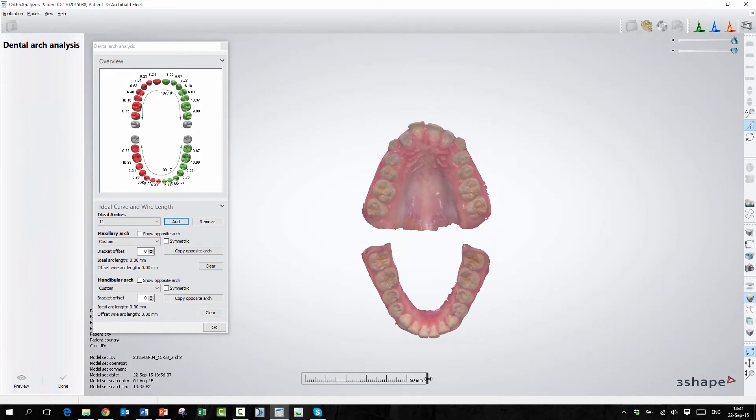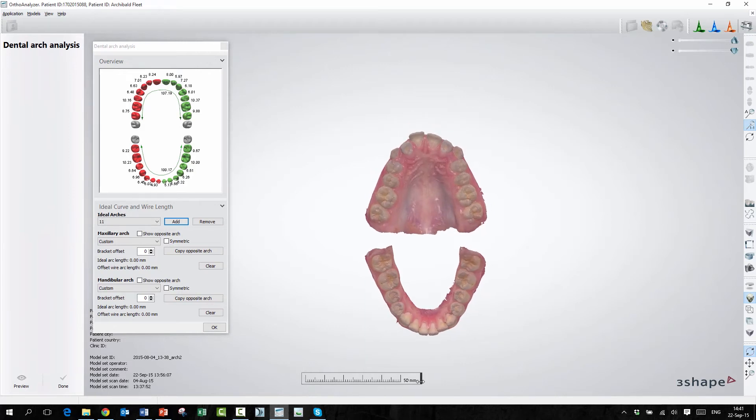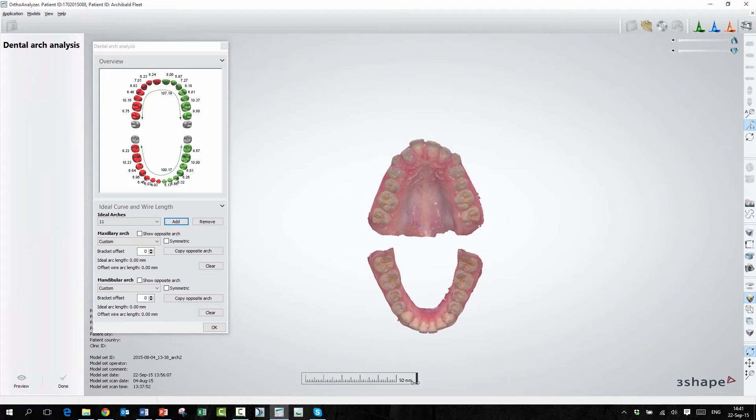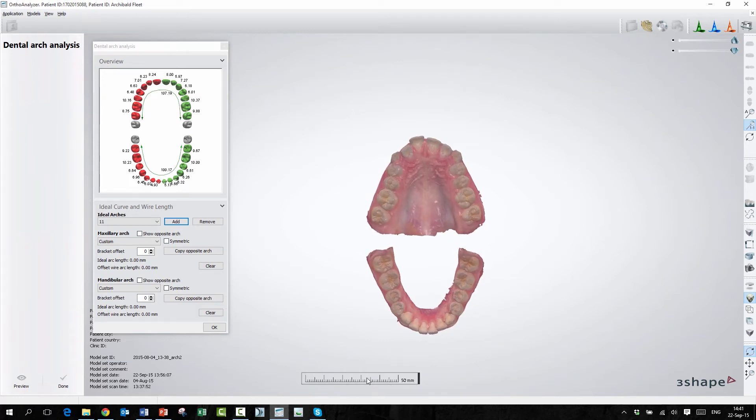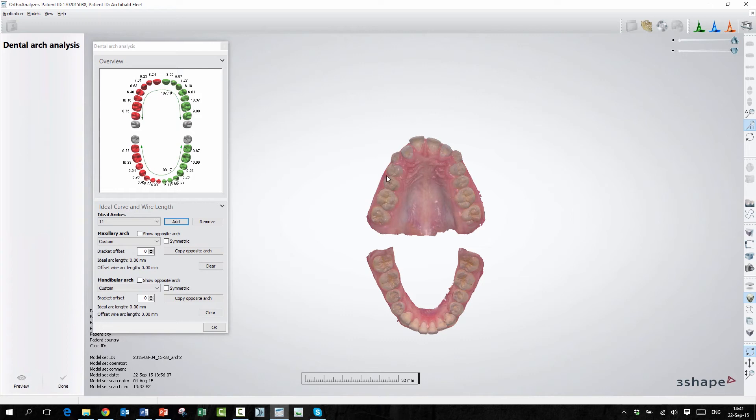So you hold basically a real physical ruler to the screen, and then you adjust that scale until they fit. Exactly. So this will be exactly 50 millimeters on your screen. Then you can take an ideal arch that you have, place it in front of your arch here, and then draw the arch wire. So analog meets digital, really? Exactly.